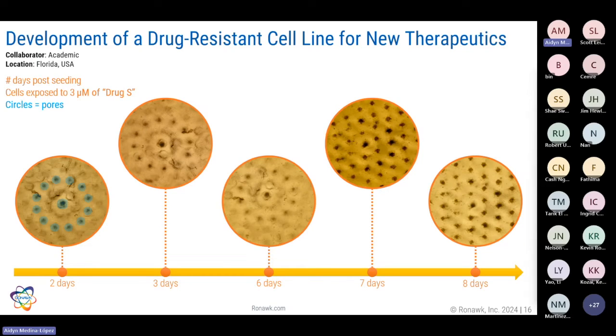The way that we designed this experiment, we had what we call a mother block. That means an initial seeding block that we add other blocks to, so the cells can be passed, quote unquote, to them, so the cells can expand more. And for every time point that I'm going to present on our next slide, they were taking out a daughter block, which were the blocks that were getting cells passed to them by the expansion of the cells to a new culture area.